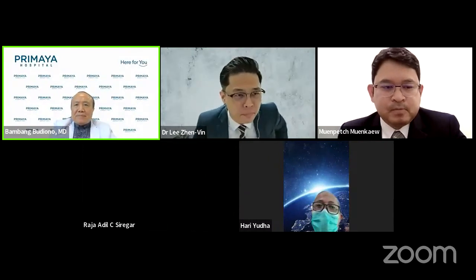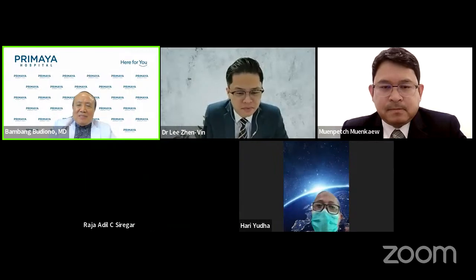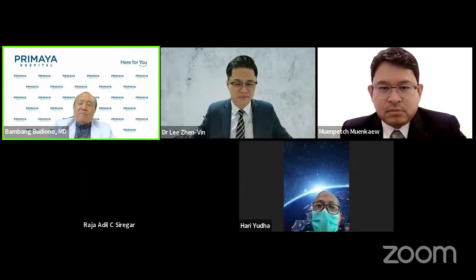Thank you. Again, I have asked Dr. Fauzi, but it remained unanswered. Let's say you have patients with CKD and estimated GFR is less than 50. Do you think that using the CT calcium score, we can still use it as a roadmap? Because sometimes, diffuse calcium we can still see even without contrast. What do you think? Thank you.